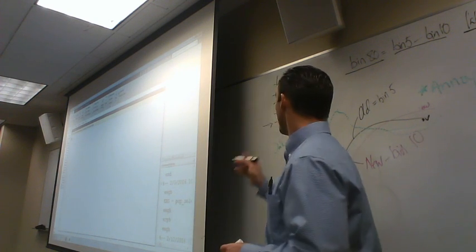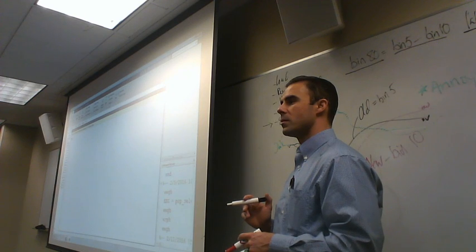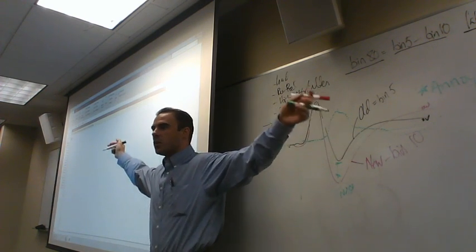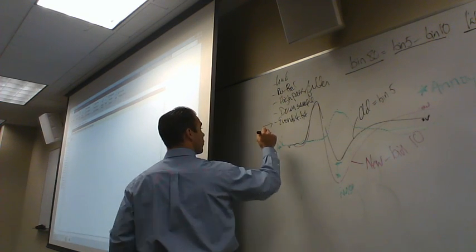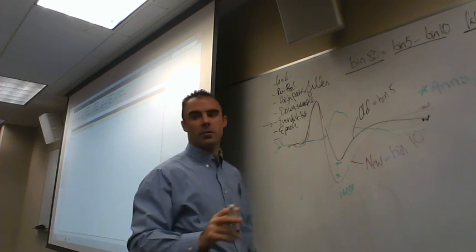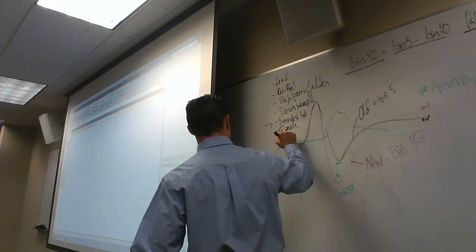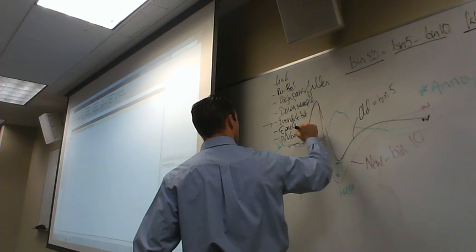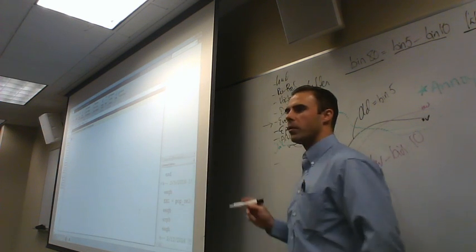And then, what do we do after we create our events list? Yeah, we epoch the data. We turn it from one long string of EEG into 300 discrete little chunks of every unit. You guys remember? So here, we'll epoch the data. Okay, what do we do after we epoch? Yeah, you're going to artifact reject. Hopefully you guys spent a lot of time practicing that for homework this week. Artifact rejection. What came after that then?